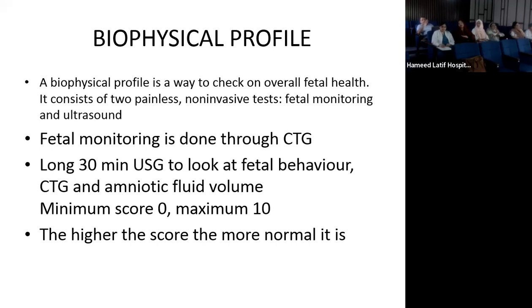Okay. What does AFI mean? Amniotic fluid index. How do you calculate that? You take the 4 deepest vertical pools, add them up, and it should be more than 5. Okay, the single deepest vertical pool is also a benefit. If you take that too, I think it should be more than 2 centimeters or so.